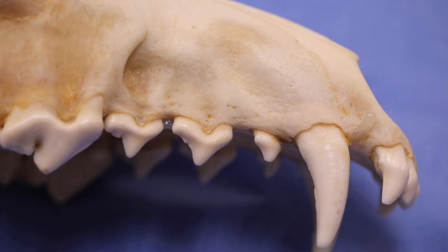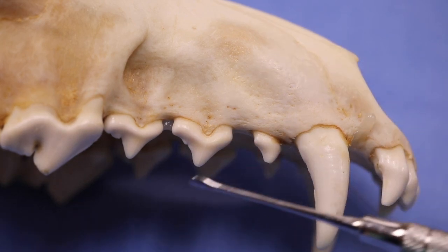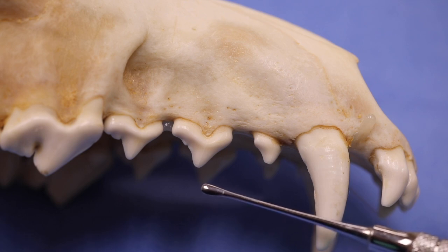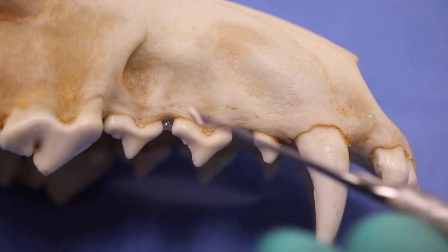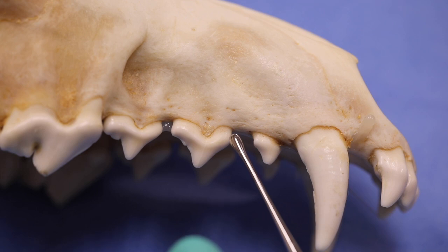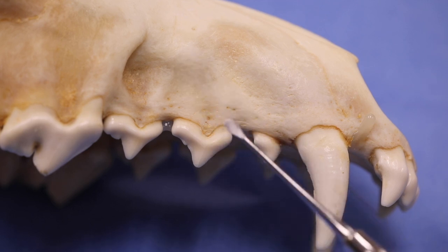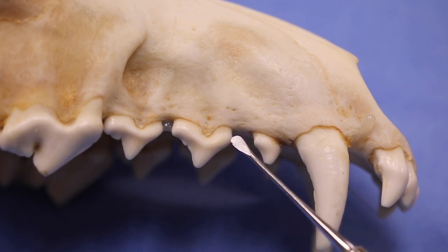A couple of important points when using a periosteal elevator. Your periosteal elevators have a double-ended function — one smaller end, one larger end. This is the small end of the feline periosteal elevator, and this is how it's positioned on the patient, with the chrome-like finish toward you. Looking at it from the other side, this is more of a milled look, and that is the side that actually goes toward the patient.